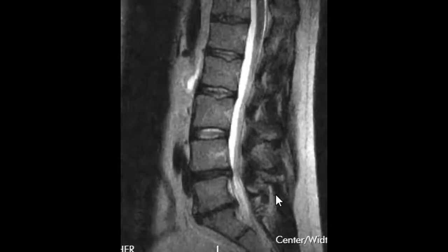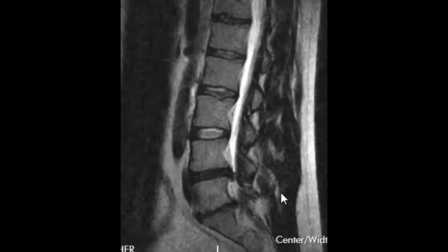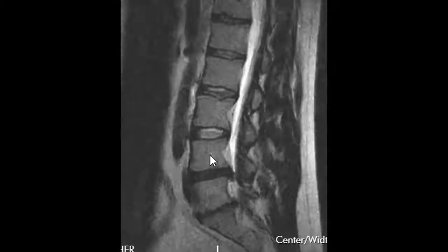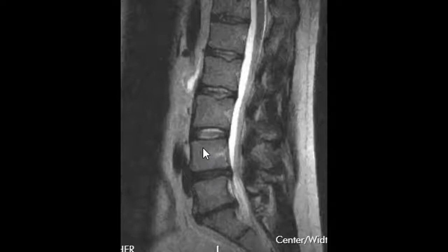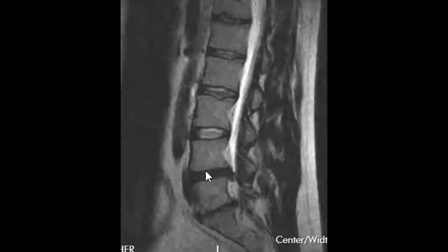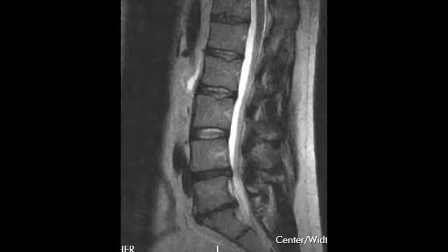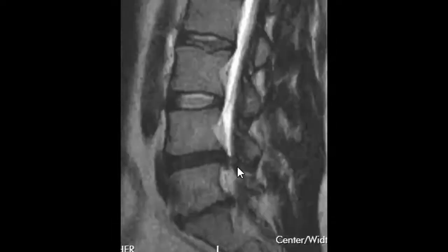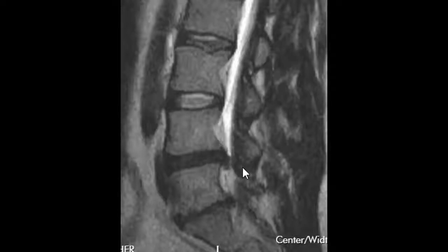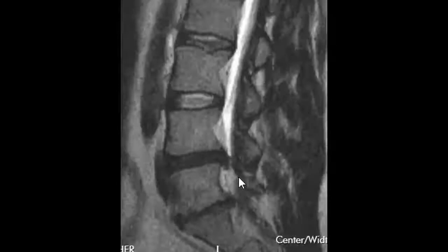I'm excited to show you your lumbar spine, and you have two abnormal discs that are causing the problem. The one that I think is most significant is right here. This is between the L4 and L5 vertebral bodies, the two lowest lumbar vertebral bodies. You have a very small disc herniation here, and it goes to the left of midline, and even though it's very tiny, it does push on a nerve that goes down to the left foot. So a very small disc herniation.